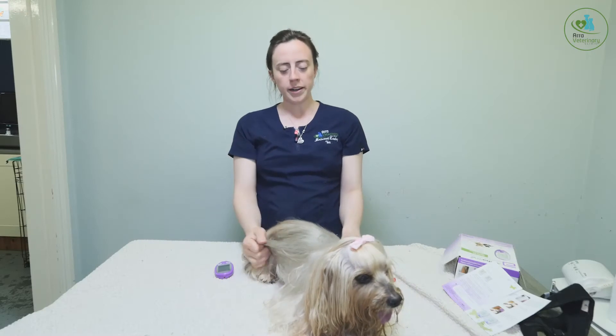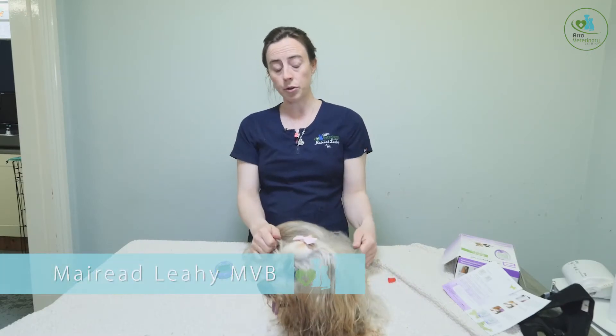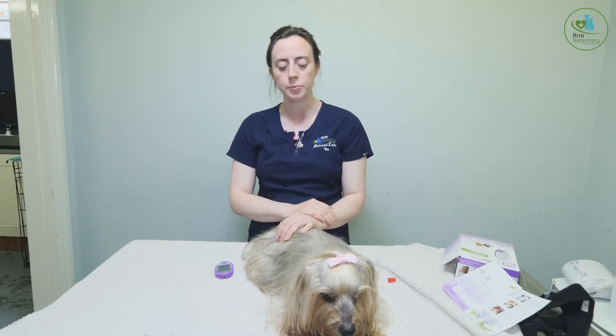We're back again with Ruby, our diabetic dog. Today we're going to discuss what happens after your dog has been on insulin for a while and how we monitor and control how well her diabetes is progressing.